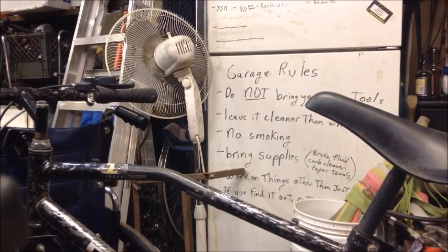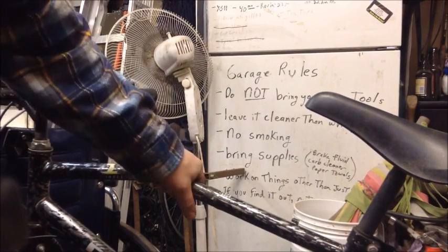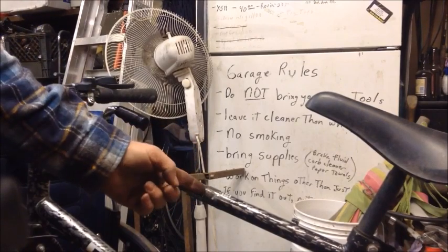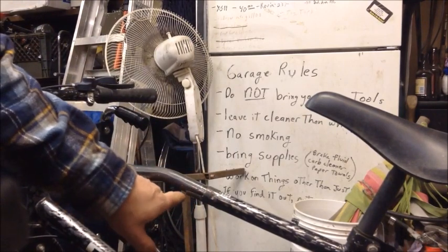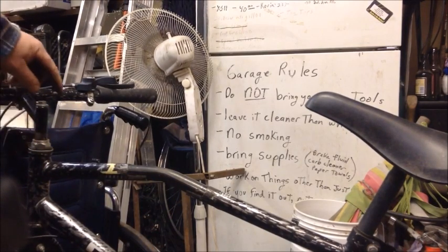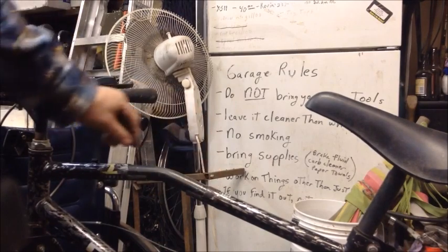All right, so as you can see, I notched it on both sides of the cut. I got my bent piece of steel, and this is round, hollow, 1 inch outside diameter. And you see how that's got a little bend to it, this angle we've created. And I've got my around 3-inch gap between the two, and that puts this headstock straight up and down. And we can raise the gooseneck to get the handlebars up. We'll get these cables out of the way. Then I'm going to fire up the welder and do a good perimeter weld, and then a couple of plug welds there and there.